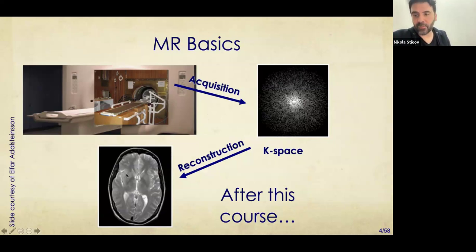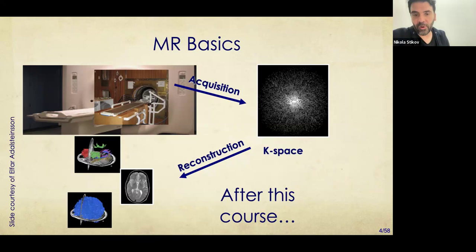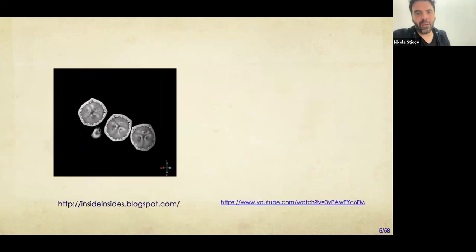And you don't only get an image of the brain, you can get different kinds of things. You can get tractography, which is different ways that parts of the brain connect to each other. You can isolate the most myelinated fibers. You can actually look at the amount of myelin that you have in the brain. So all of these are different kinds of applications that we'll touch on a little bit today, but time is too short to tell you all the different ways in which MRI is useful.